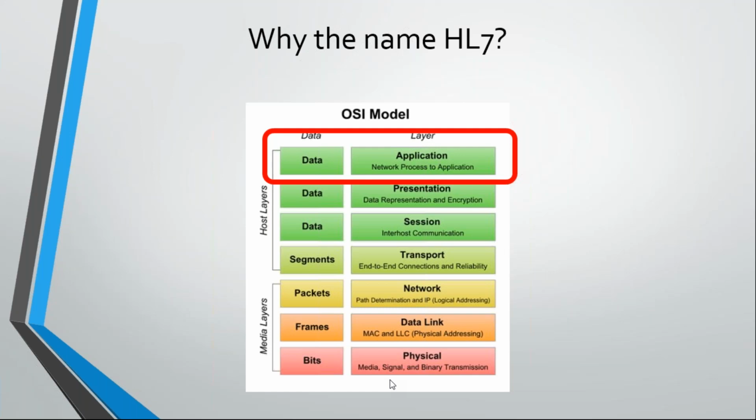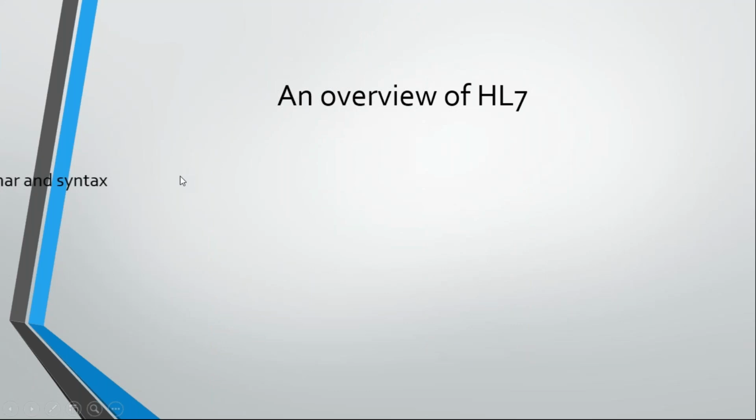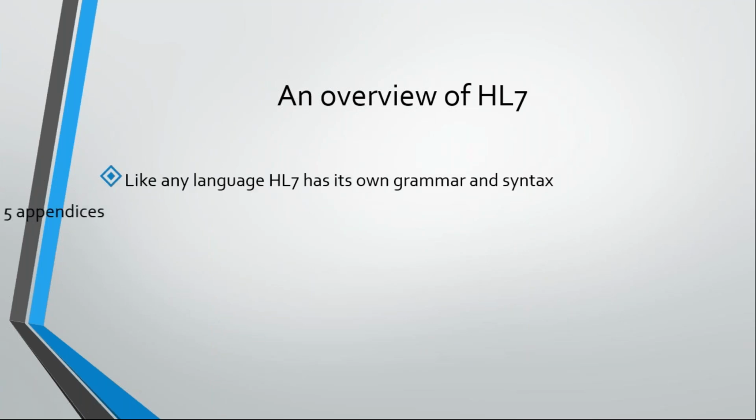So as we are operating the health data at the 7th layer, it is called HL7. That is how the name has been arrived. Next we'll take a look at the next slide. We'll take a quick overview.